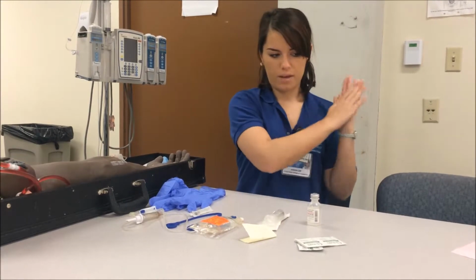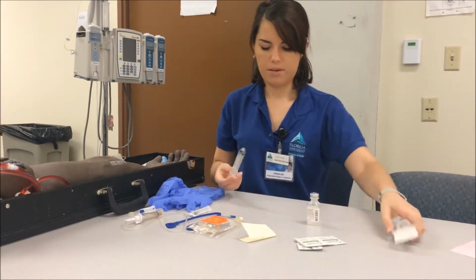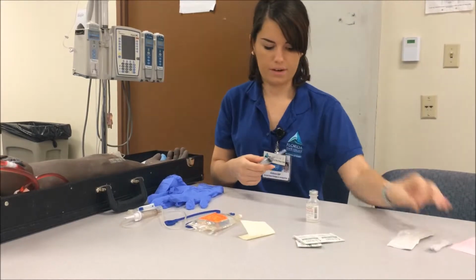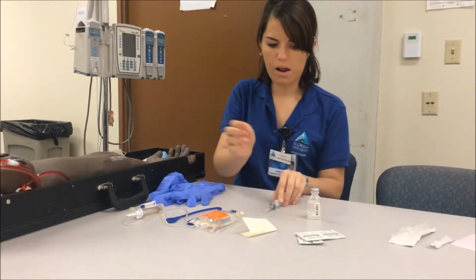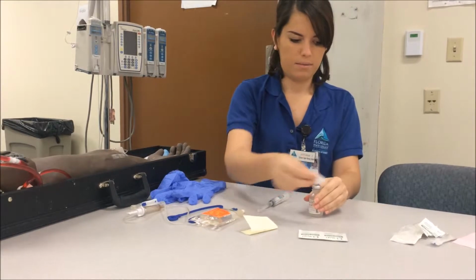So now I'll go ahead and perform hand hygiene, and I'm going to infuse my 0.5 milliliters into my bag. Okay. So I'm going to aspirate for 0.5, like so. Go right ahead and clean my Phenergan.